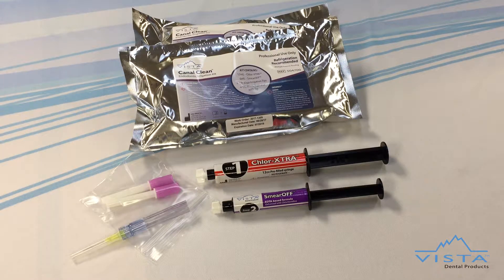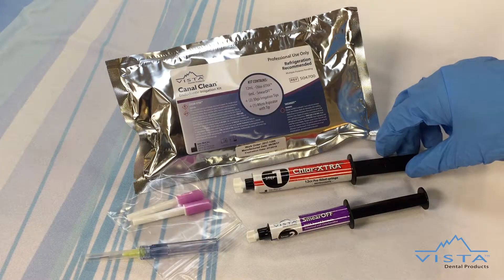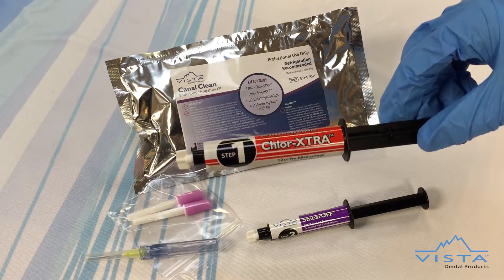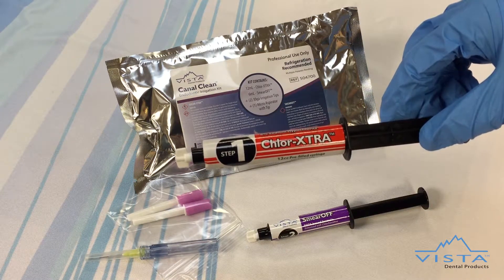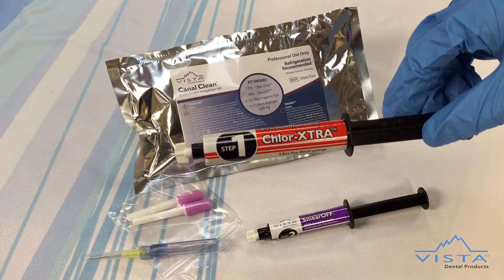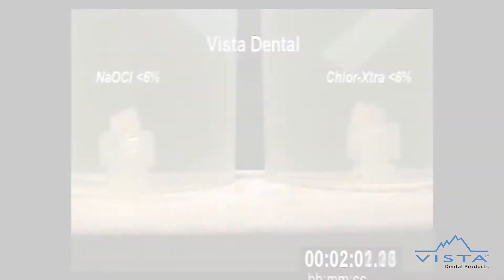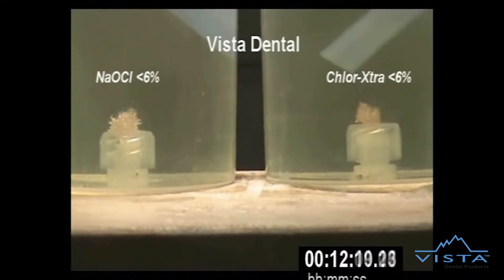Best yet, these affordable irrigation kits equate to $8 per procedure, costing no more than the price of buying individual components. Step 1 features our patent-pending solution, Chlorextra, which is a pharmacy-diluted 6% sodium hypochlorite solution enhanced with proprietary surface modifiers and wetting agents. Chlorextra is clinically proven to improve penetration and dissolve tissue two times faster while reducing post-treatment complications.